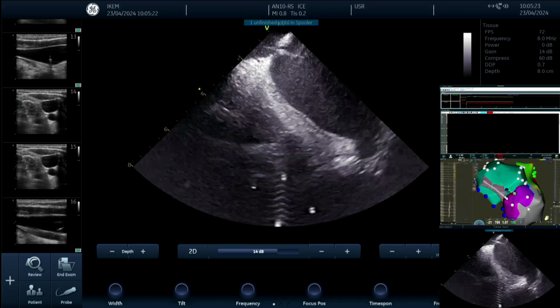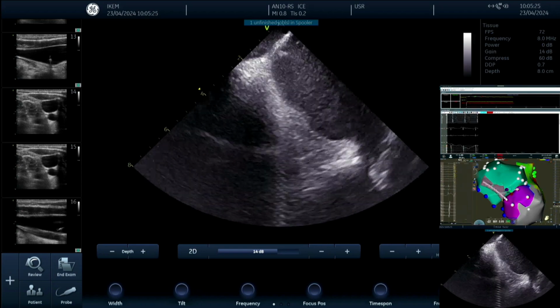So as you can appreciate, this is basically an anatomically guided procedure in a way to see where is the ganglionic plexus or plexi. As you know, there have been several strategies suggested, like high frequency stimulation on site of the ganglionic plexi, or some people try to image with MIBG. We did also in the past. So you see still the reaction is preserved.